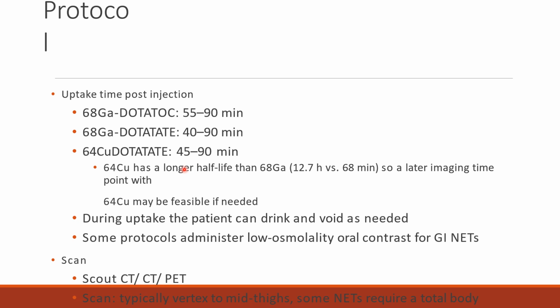Especially if you're at a facility where you're using gallium DOTATATE and copper DOTATATE, it's just easier to keep them straight if you keep the same protocol for both as far as the uptake time. Now, copper has a longer half-life. It's 12.7 hours versus 68 minutes for gallium. And so a later imaging point with copper may be needed.